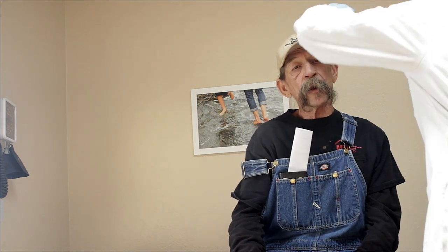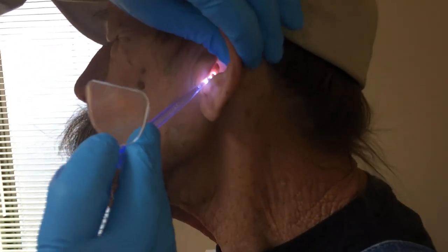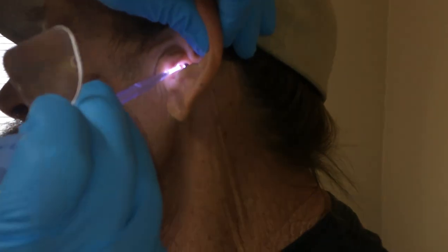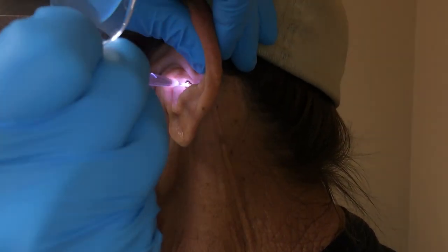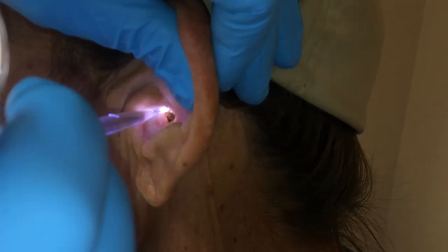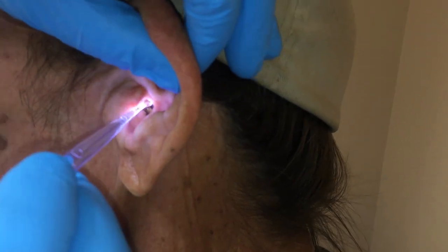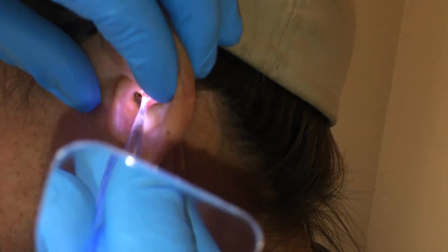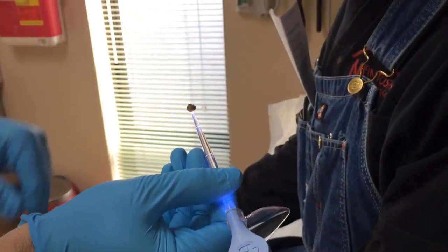The way I remember, you guys used to have me lay in here and put goop in it. Oh yeah — there's your drum. Now it's reached a point where we need to grab it. Are you guys seeing this? That was the chunk that was left behind.